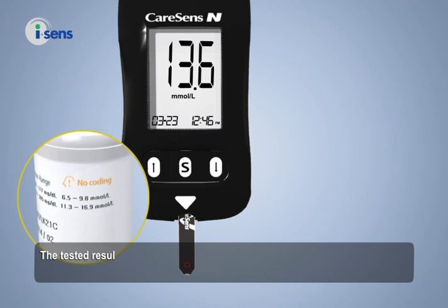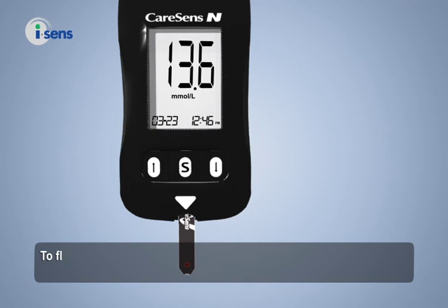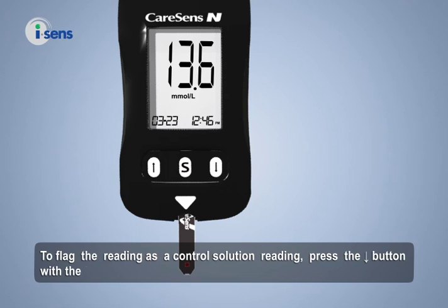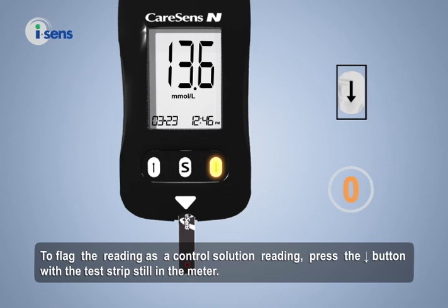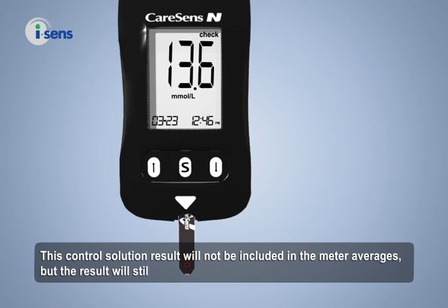The tested result cannot be erased from the meter but can be flagged with the word 'check' and will not be included in the averages calculated by the meter. To flag the reading as a control solution reading, press the downward button for 3 seconds with the test strip still in the meter. The word 'check' appears on the screen, and this control solution result will not be included in the meter averages, but the result will still be stored in the meter.